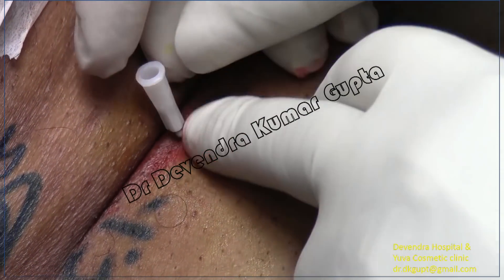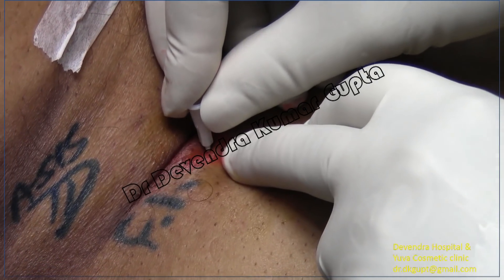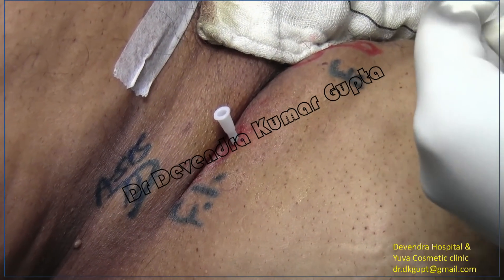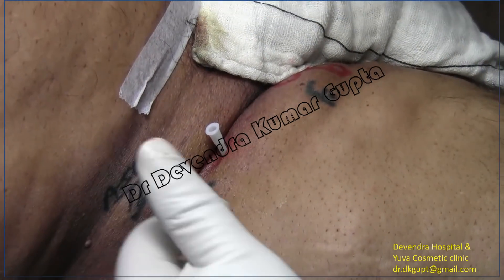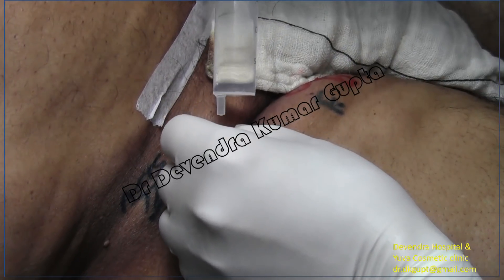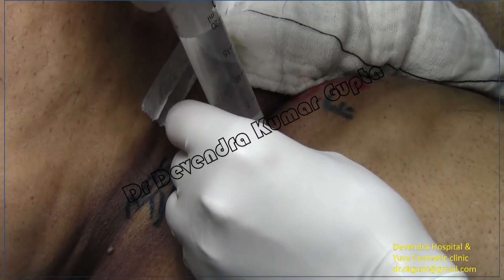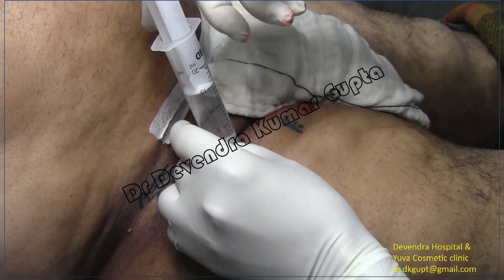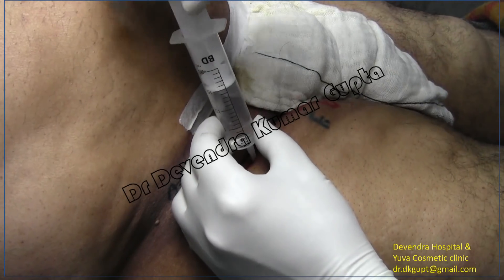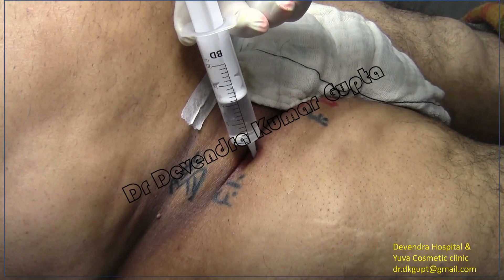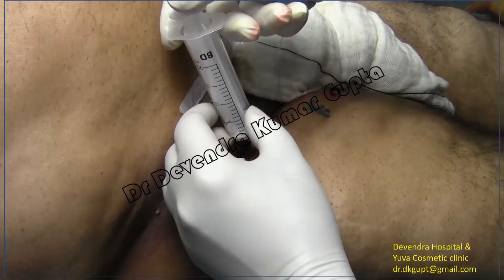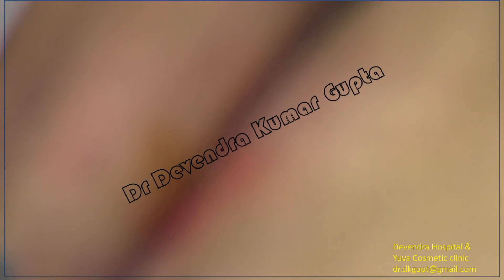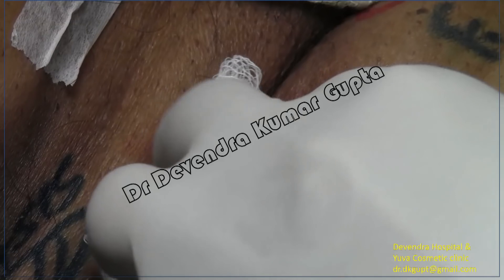Now I have gone through both fasciae — fascia lata and fascia iliaca compartment — and the whole needle has gone inside because of the fat. Stabilize the hub of the needle, aspirate, and see there is free flow. Turn the needle, aspirate to check if there is any blood — no blood — then inject. The solution flows very fast. This is the completion of the fascia iliaca compartment block. See the regurgitation of fluid — this indicates fluid in the compartment. Just massage the area; the block is complete.